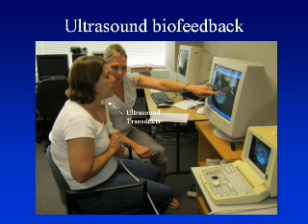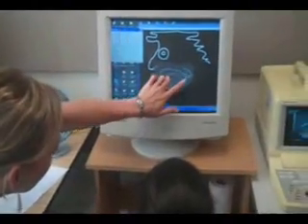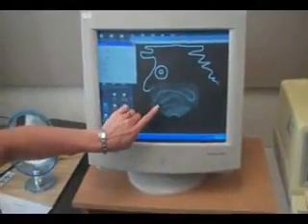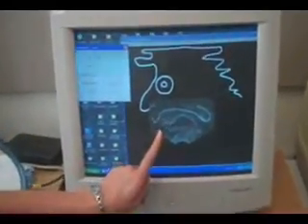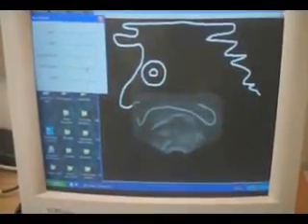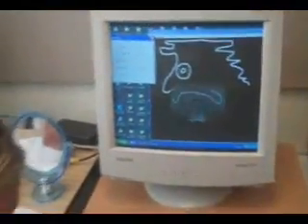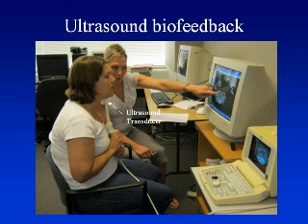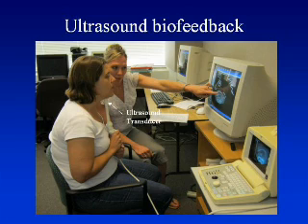We're now going to show you a video clip of a client in therapy using the ultrasound. There's the tip of your tongue which moves up when you say T, and you can see how the back of your tongue moves up as well. In our experience, we have found that ultrasound can be a useful adjunct to articulation therapy. The visual feedback ultrasound provides can help clients to understand the movement of their tongue during speech and understand articulation therapy goals.